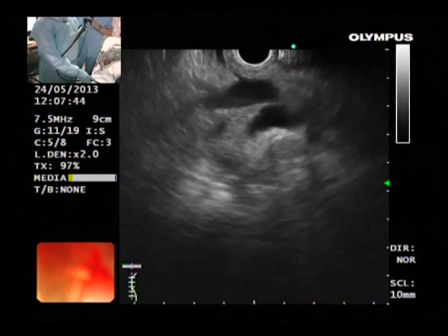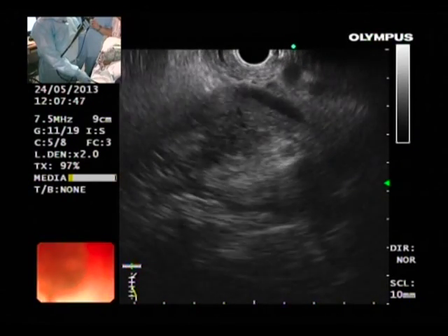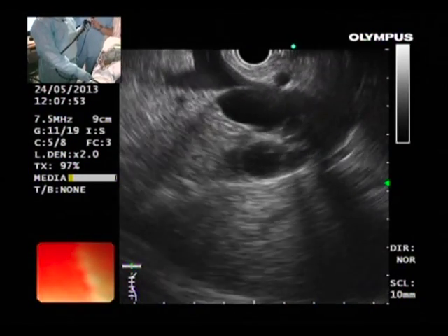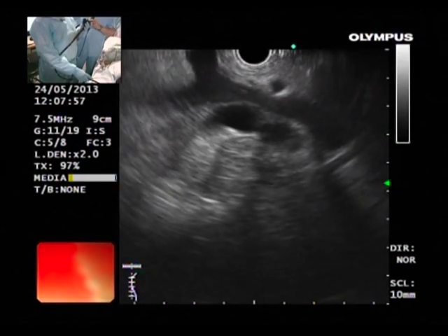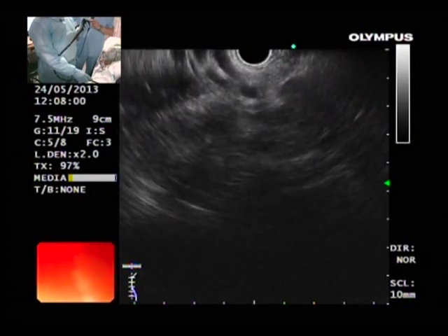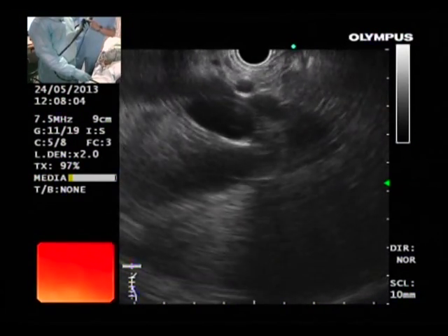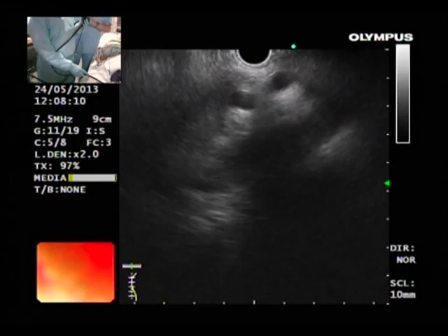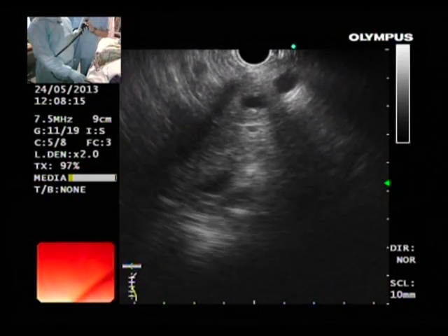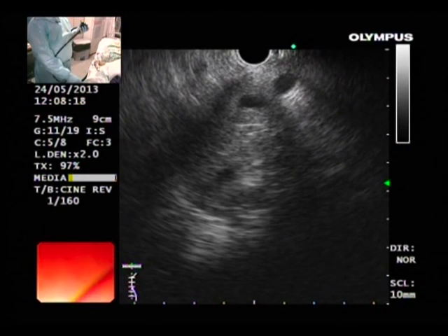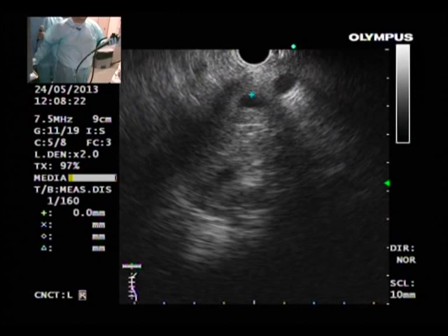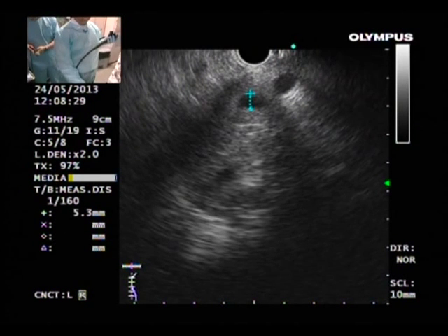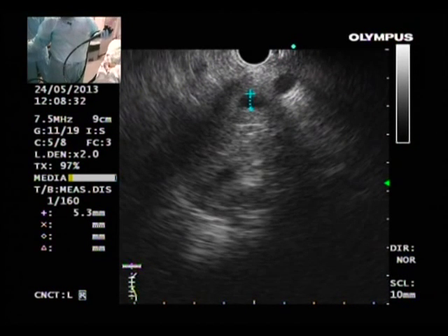If we go a little clockwise, we have seen the head of the pancreas from the stomach, a dilated bile duct, and the superior mesenteric vein. Following it back you will see the confluence — this is the confluence and the portal vein. Going posterior, we are seeing the pancreatic duct — 5.3 millimeters, dilated. So we have a double duct sign here: both the CBD and pancreatic duct are dilated.